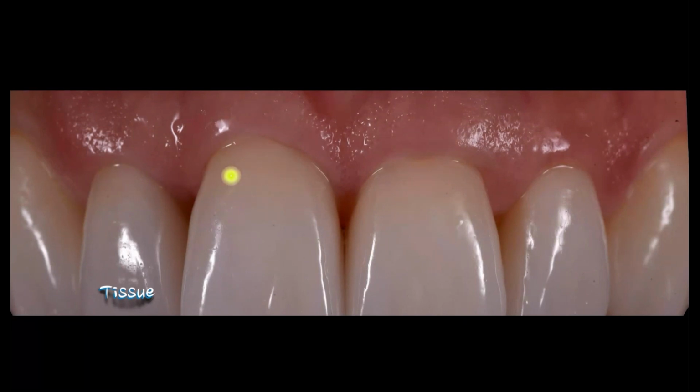And again, for lithium disilicate, I'm pretty happy with the gingival architecture here. I think I'm struggling with that more and more, but the last 2 or 3 cases that myself and Helen have done, we're kind of looking at them and feeling like, yeah, it's getting there. It's getting better, and it's really just about how we're treating that gingival finish line.